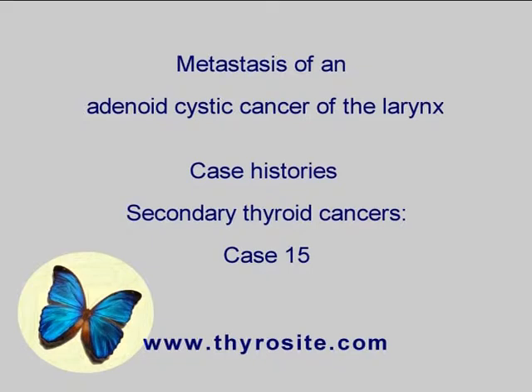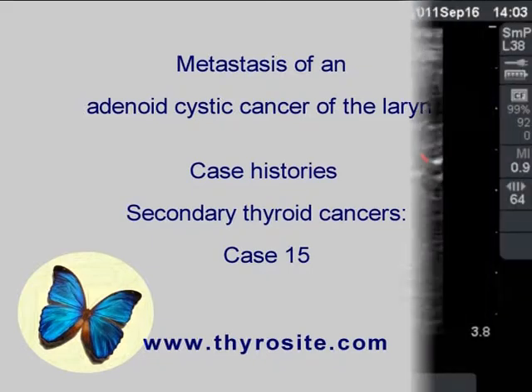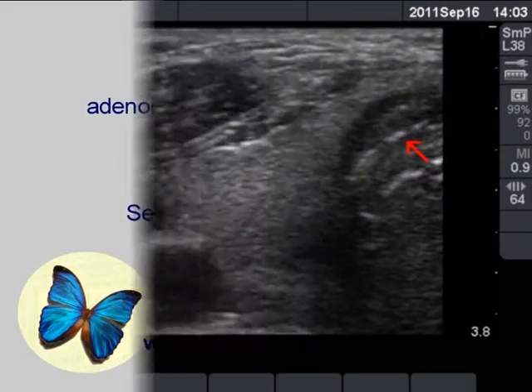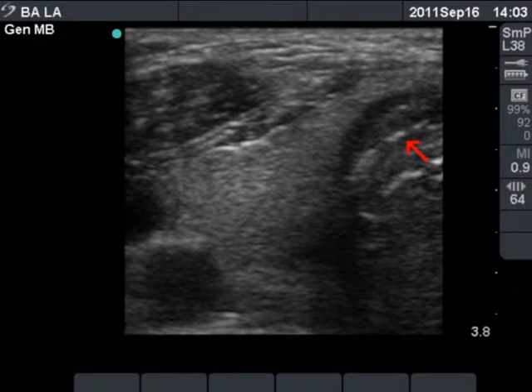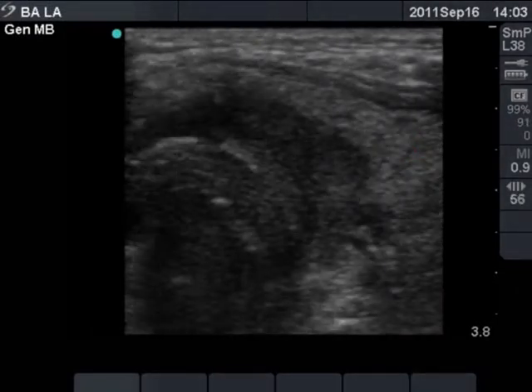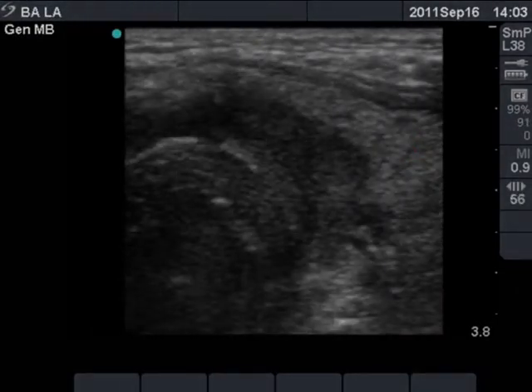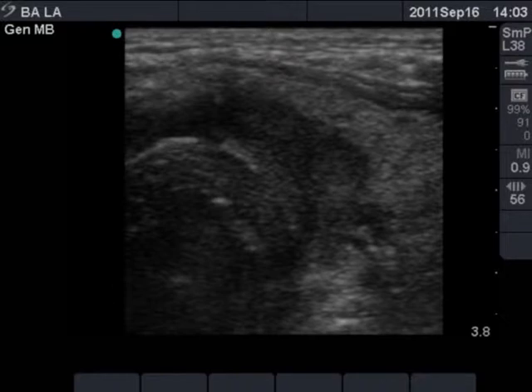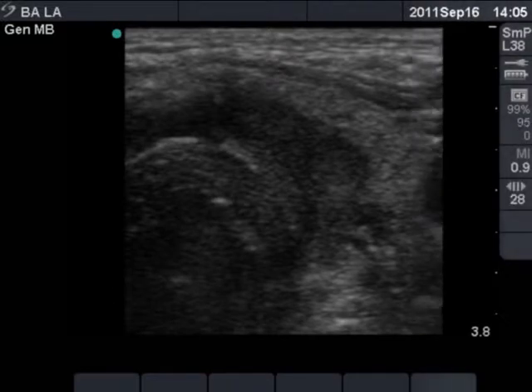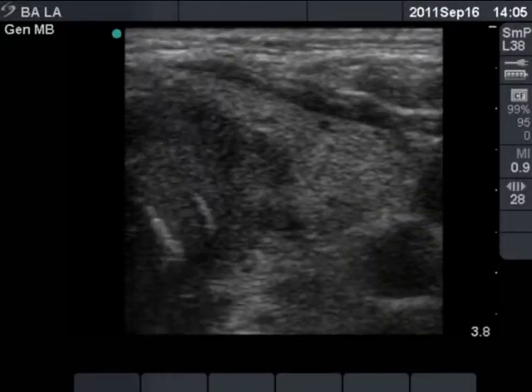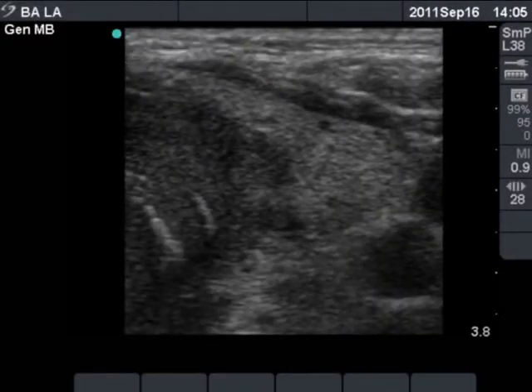The patient was evaluated because of palsy of the left recurrent nerve. The red arrow points to a hypoechoic, infiltrative tumor in the dorsal part of the isthmus. The greatest part of the tumor is located in the left lobe.